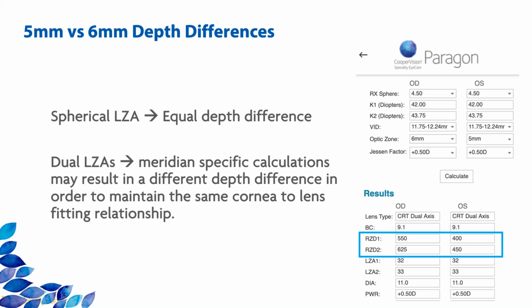Correct. Even though I'm not blinded from the study, by the way, all of the subjects are semi-blinded from the study design. Most of them are optometry students. If they care to look with their slit lamp, they will notice the drastic difference in terms of the RZDs.